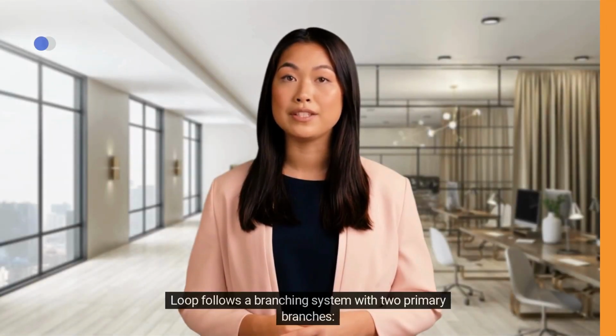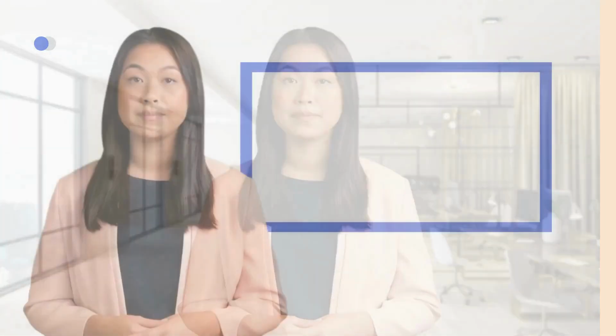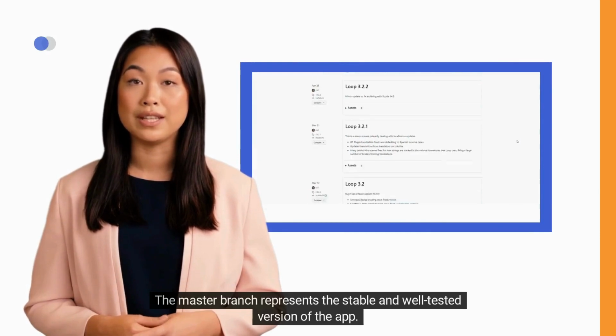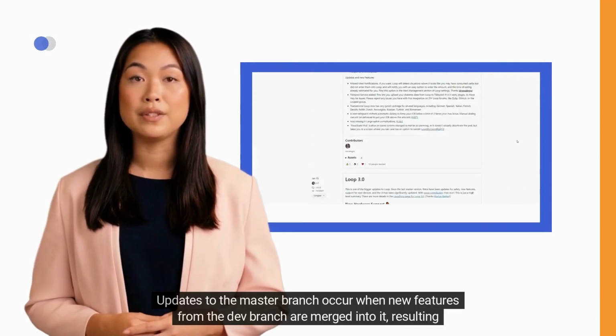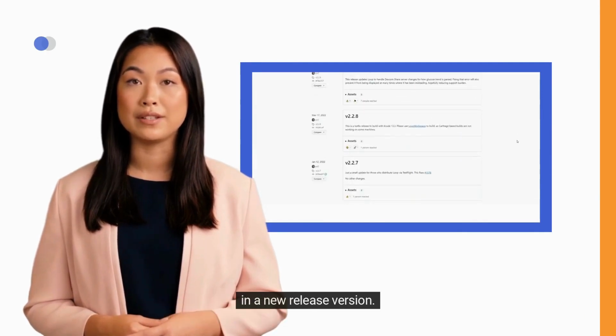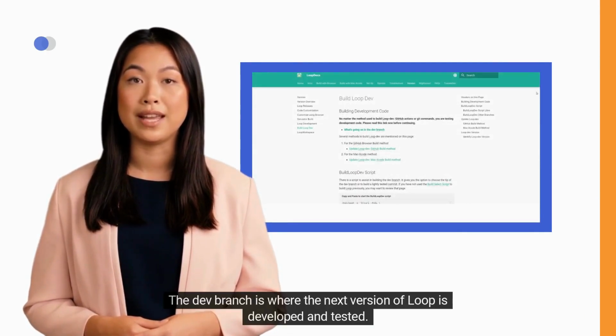Loop follows a branching system with two primary branches, Master and Dev. The Master branch represents the stable and well-tested version of the app. Updates to the Master branch occur when new features from the Dev branch are merged into it, resulting in a new release version. The Dev branch is where the next version of Loop is developed and tested.